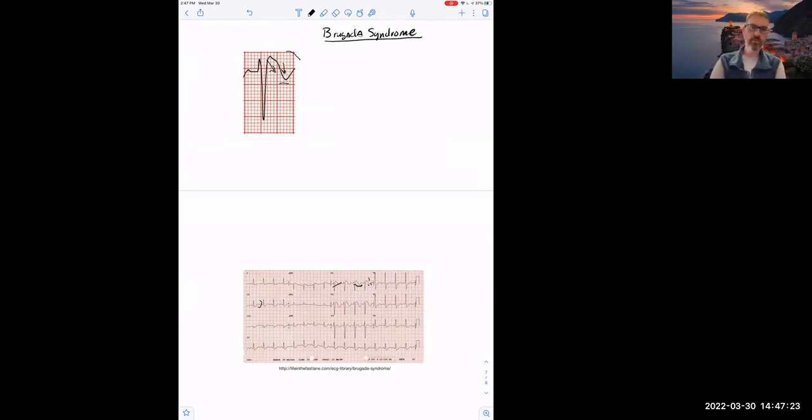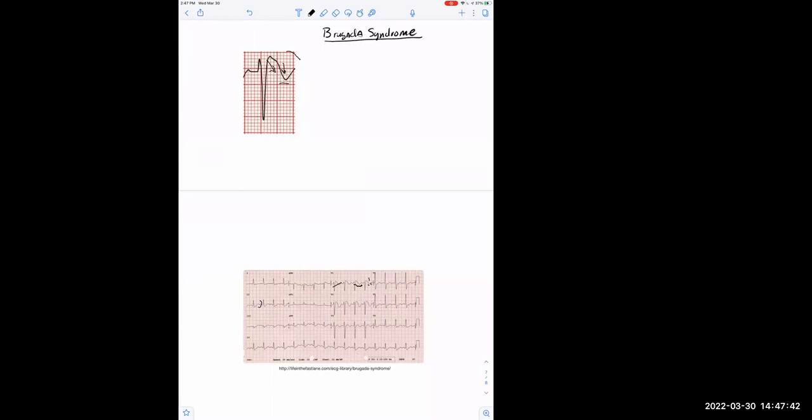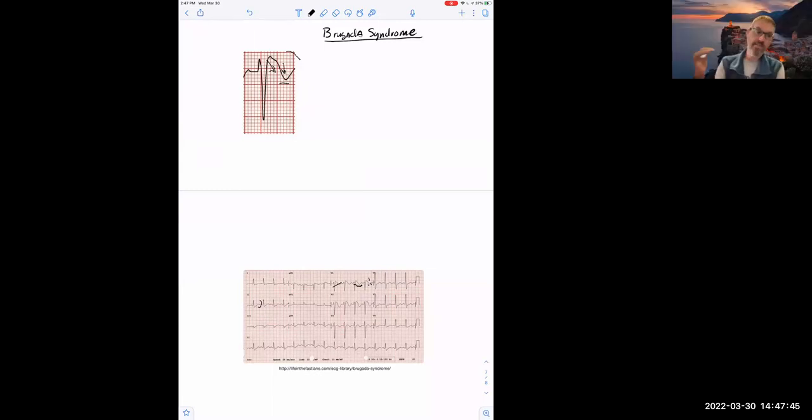I'm going to put the first 12-lead up, and then I'm going to give you all a couple of minutes to look at it and interpret it. So remember, take the systematic approach. See all leads. Do that first. Inferior, 2, 3, aVF, septal, anterior, lateral, and then think about posterior and right ventricle if you suspect they need to be further investigated. Now I'm going to share my screen with you, and I am going to share the first 12-lead. Let me do that right now.